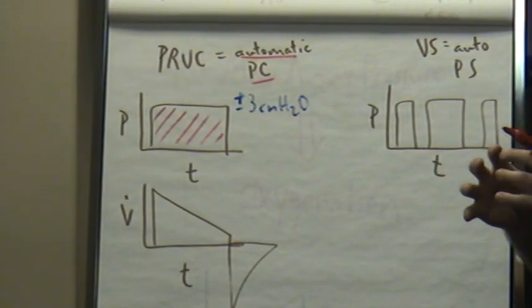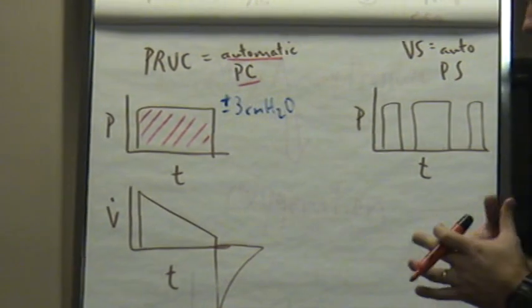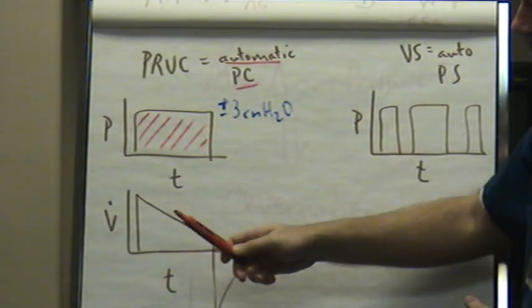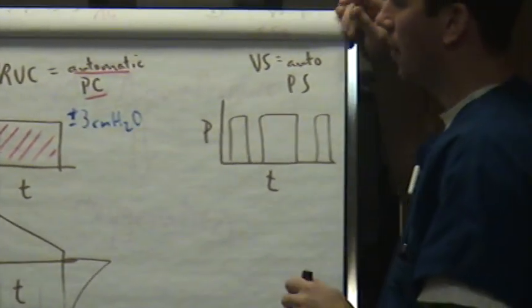You truly get more of an average pressure in the lung, which is called the mean airway pressure. So another benefit of PRVC is you get a higher mean airway pressure with the same given tidal volume as a volume mode. So you get better mean, and you get less peak pressures because you have a gentler flow pattern. So that's PRVC. Why would we switch?